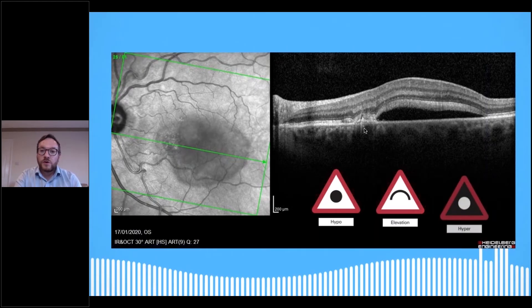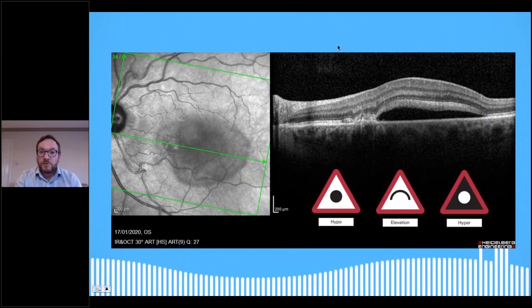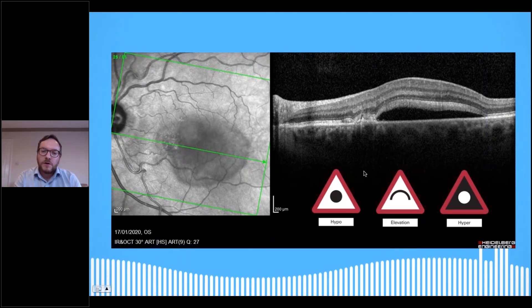We've also got areas of hyperreflectivity with some bits just down here that aren't quite right. The obvious thing to do is to look at the large hyporeflective area and jump in with the diagnosis of CSR or CSCR — central serous retinopathy. I saw that, but because I'm trying to use a systematic approach, the bit that bothered me more was this little area here — where you can see some scattering of hyperreflectivity and hyporeflectivity. My concern was that this was potentially an early CNV — an early choroidal neovascularization subsequently causing the CSR and the fluid underneath the retina.